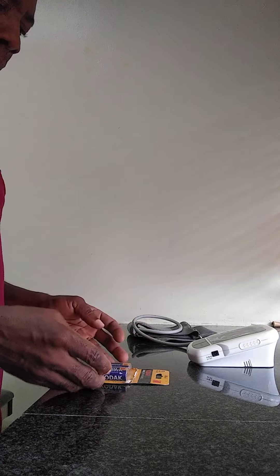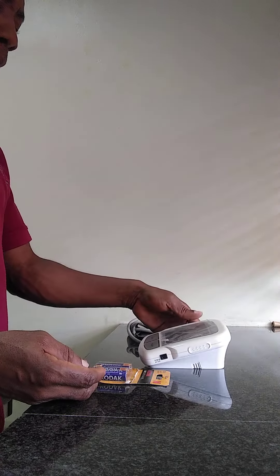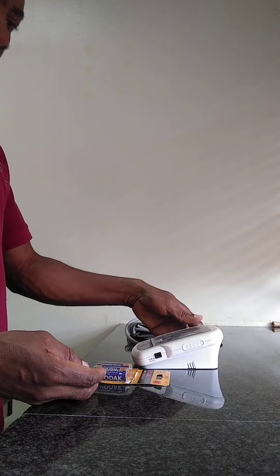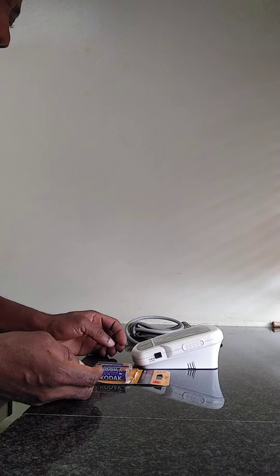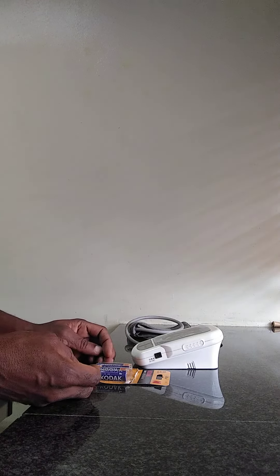Today we are going to be looking at how to insert a battery into an automatic blood pressure monitor. This is the battery.